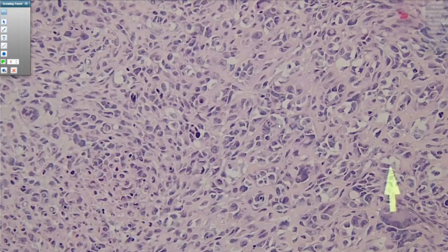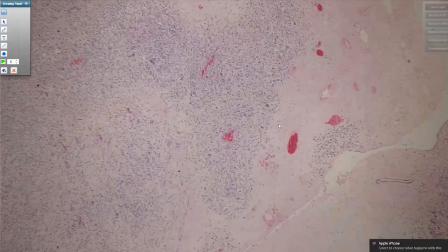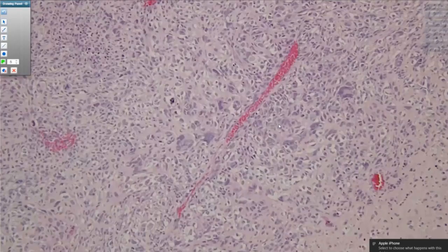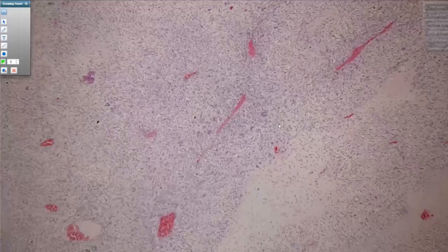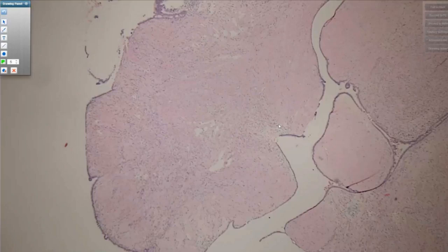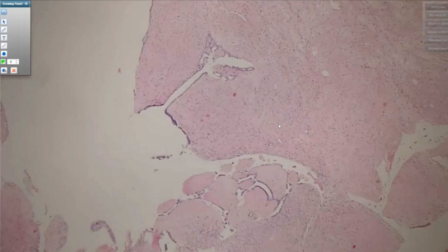And if this were the only section we have, with a lot of necrosis in these atypical cells, it's very difficult to make a definitive diagnosis. Additional sections of the same lesion show areas, again, with overtly leaf-like architecture and lower grade component, which helps support the classification of this entire lesion as a malignant phyllodes tumor.